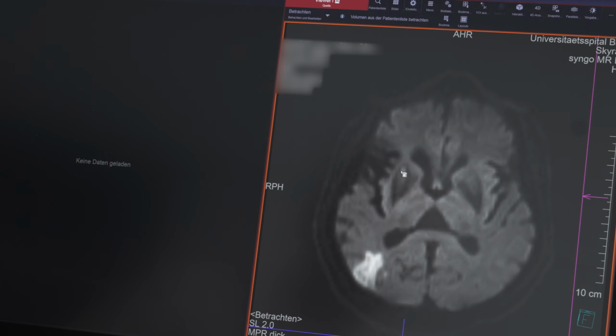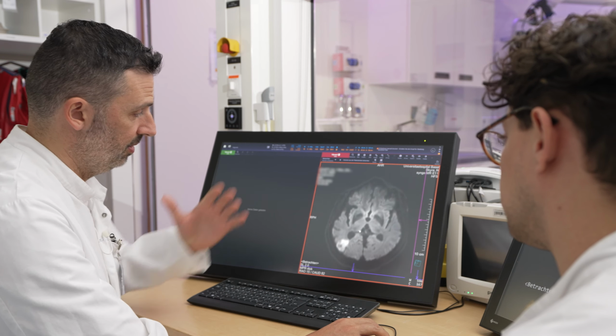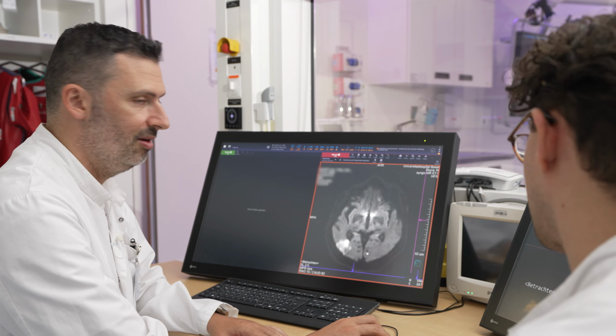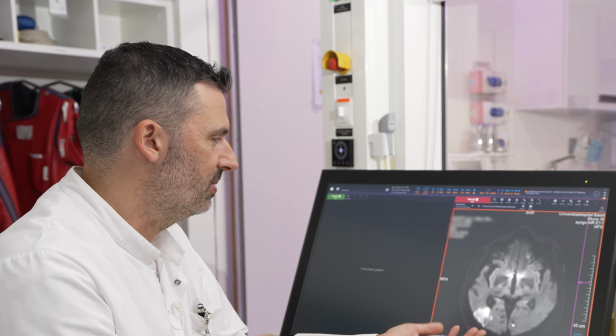You have some smaller DWI lesions there in the territory of the superior trunk, but obviously this did not recanalize, so we have this bigger infarct there. But again, luckily for the patient, without any consequences. This is just one case.